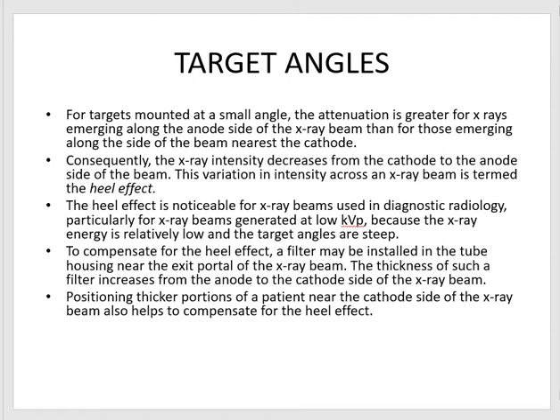The effect stems from the absorption of X-ray photons after they leave the point where the X-ray is produced in the anode. This absorption depends on the distance that the photons need to travel within the anode material, which in turn depends on the direction of the emission.